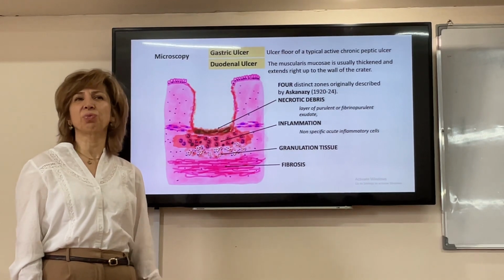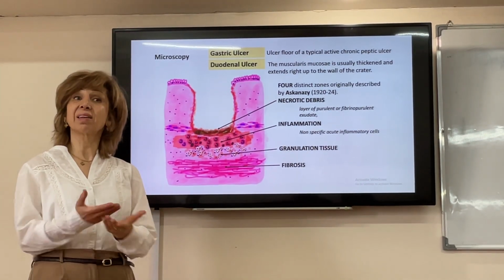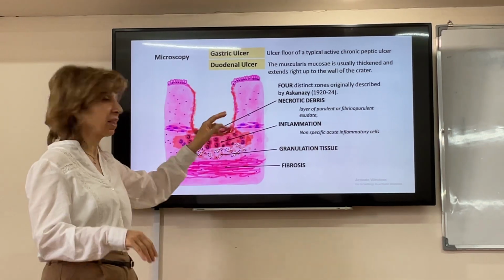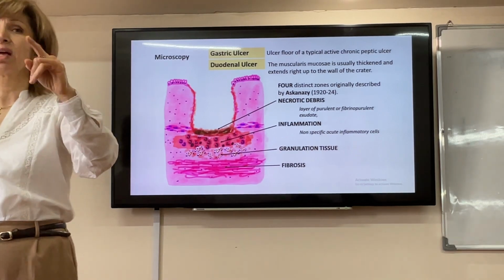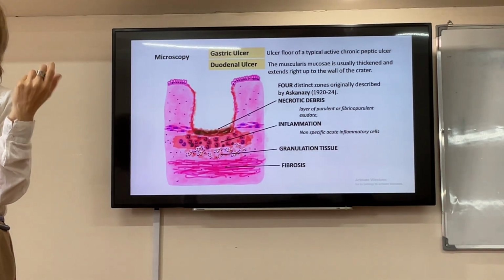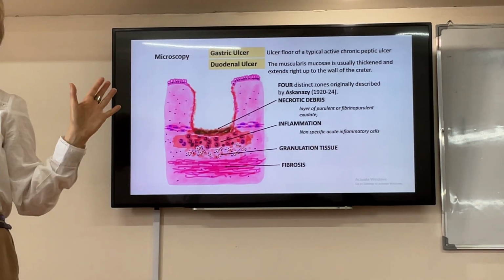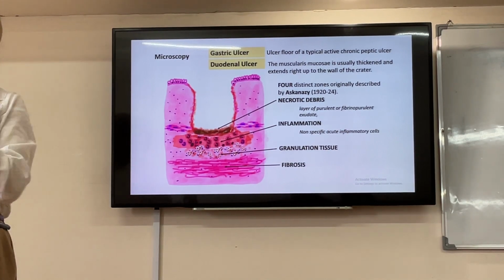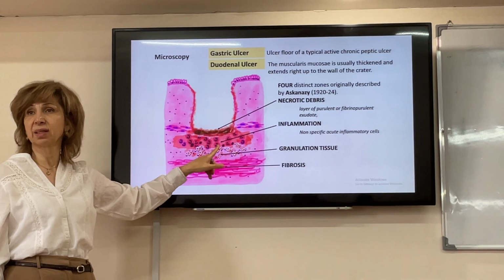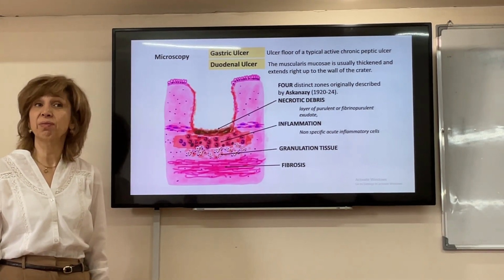All right, please don't forget this. Yes, it's very, very important. What is the base of an ulcer, any ulcer? First, if it is superficial, we study the superficial, the skin, they are labile, so they just regenerate. So with superficial erosions, I don't have problems with the ulcers. They just close. The problem is when I have deep ulcers. What will I see? Granulation tissue. Okay? This is very, very important.